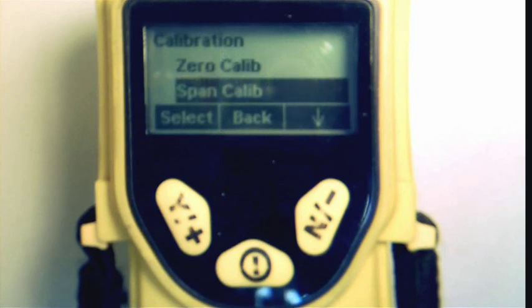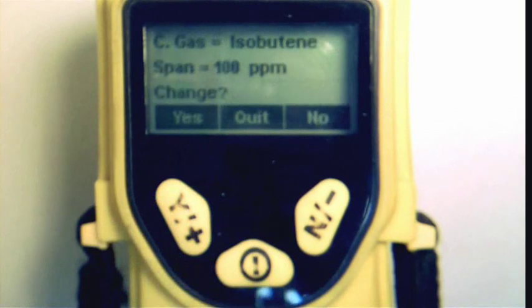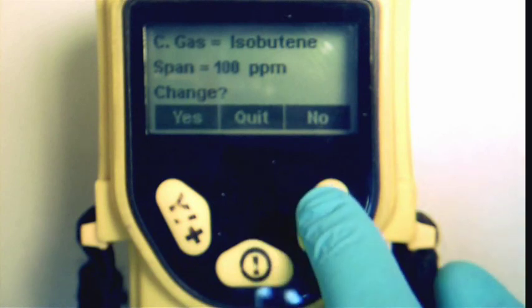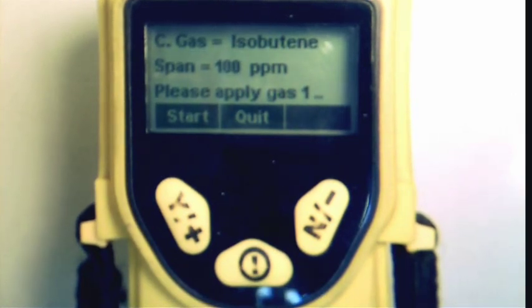Once the zero calibration is complete, press Y to select span calibration. The display will show the current gas and concentration and ask if you want to change this. If no change is needed, press the end button. Please note that isobutene is another name for isobutylene.